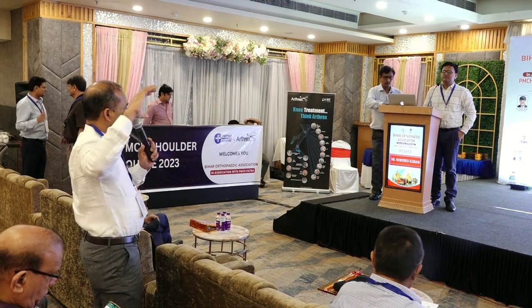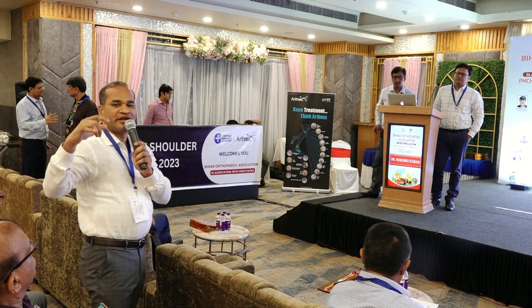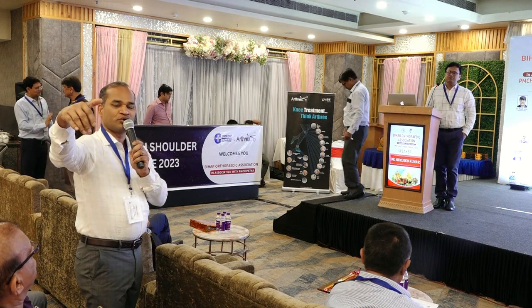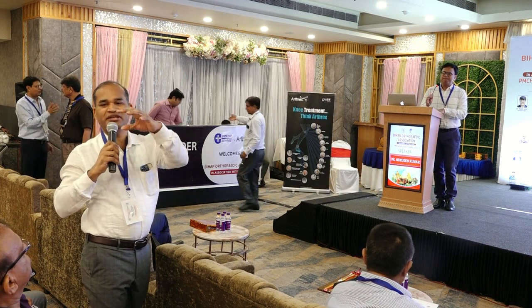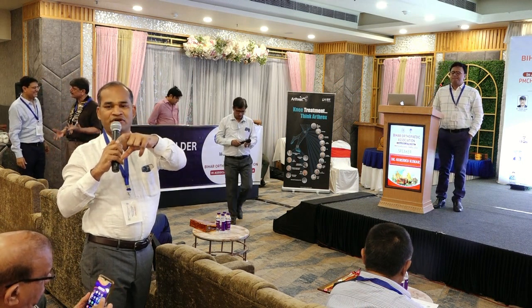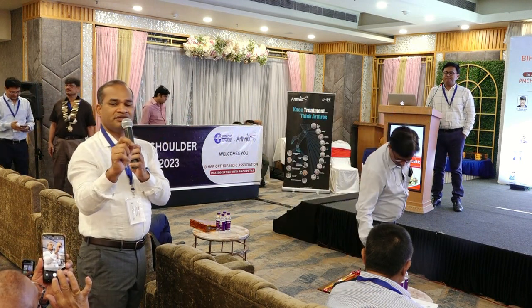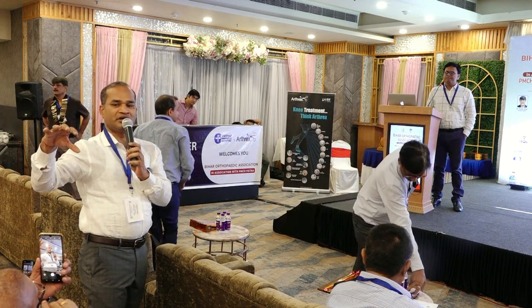It's the distraction of the shoulder joint. You should feel the coracoid with one finger and the soft spot with another finger. And third thing, once your scope is in, don't directly open the water.